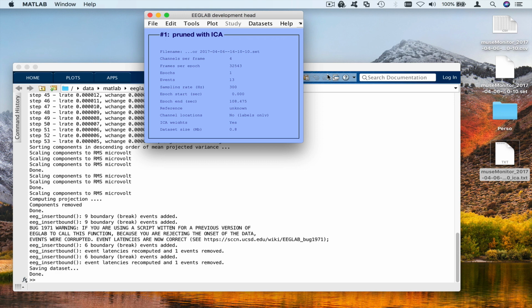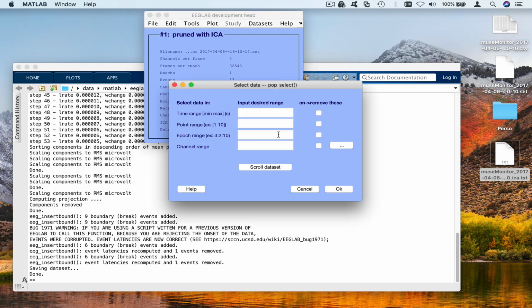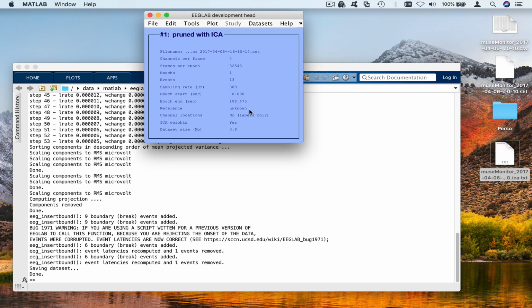And to remove data channels, you go to this menu, select data, and then you select the channel you want to remove. In our case, at the very beginning, it would have been 1 and 4, but ICA was able to correct them. And you can remove the channels either before cleaning the data or after cleaning the data. Make sure if you do it after cleaning the data, you're checking the data after removing them as well. So here we don't need to do that since after running ICA, all the channels were pretty good.